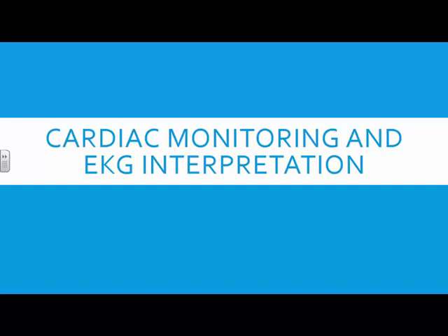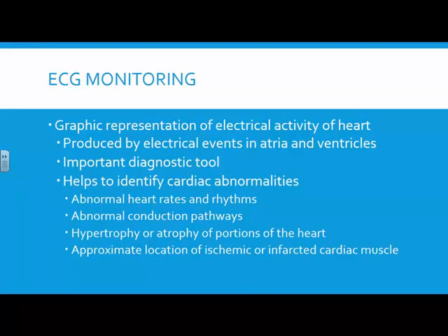Because next week we'll get through what we can of cardiac monitoring. Next week we will really get into some EKG interpretation. All right. So ECG monitoring. ECG monitoring: graphic representation of the electrical activity of the heart.